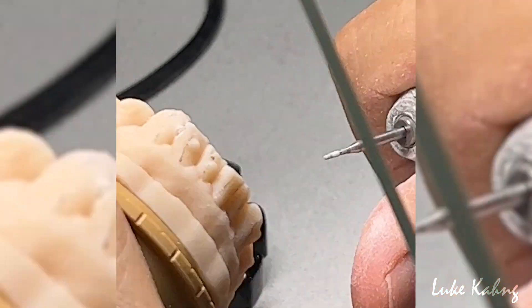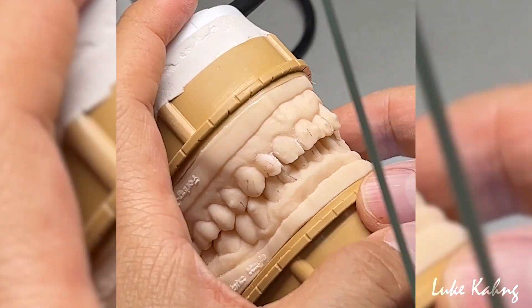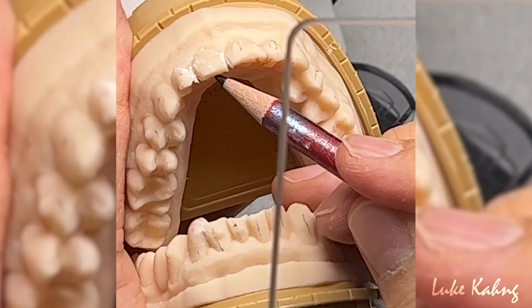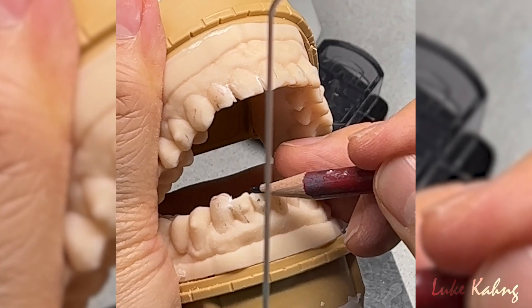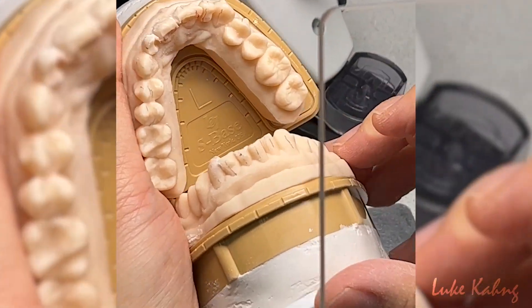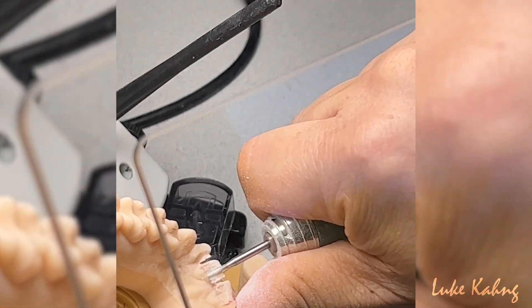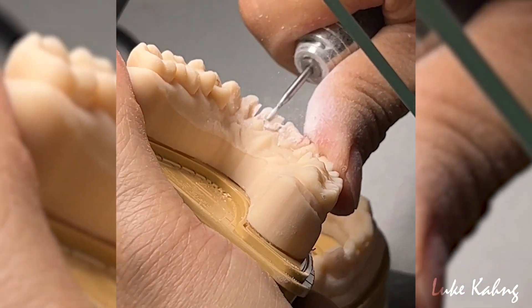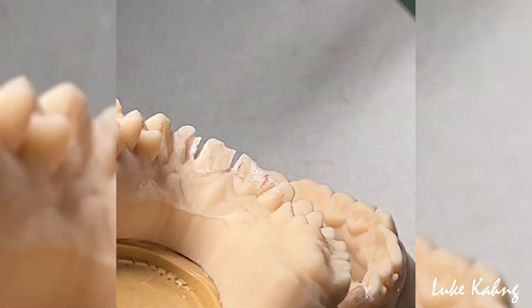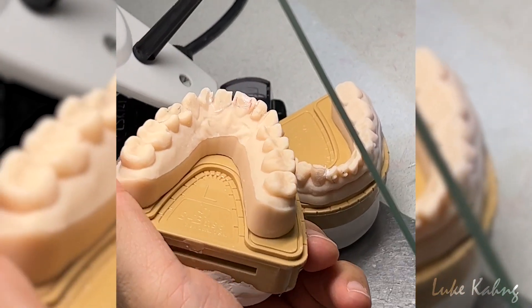I'm going to do one by one, from the top and bottom. Then I can see how much I can reduce it. Here is already low, so I have to grind more here. There's a lot of enamel here, there's not much enamel there, so I have to grind less. I have to grind more lingually — this side 3 unit. So I can create more room compared to lower, then I shouldn't have any much problem.